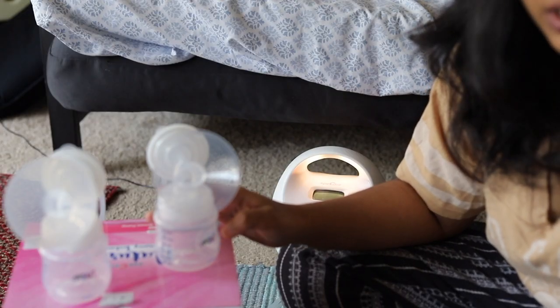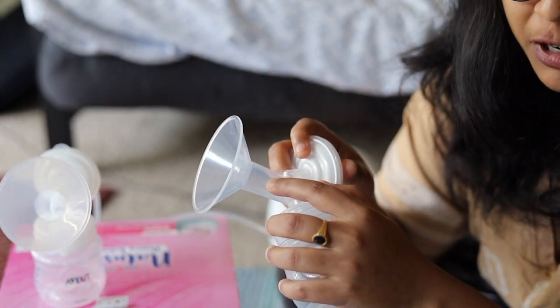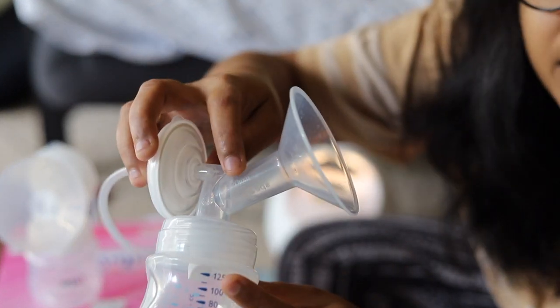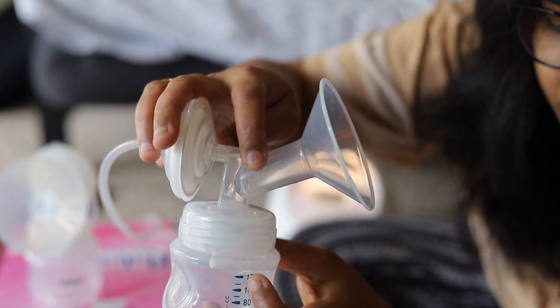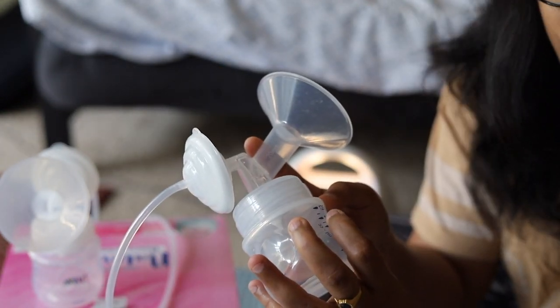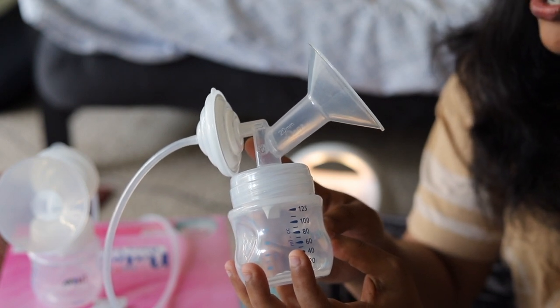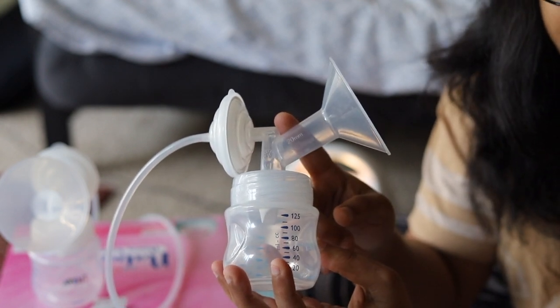Now let me explain the pump parts briefly. First is the flange — the funnel-shaped part that actually goes on to the breast. On the side there is a number listed, for example 20 mm, which is the nipple diameter. You have to choose the one that fits your size. If you use an incorrect size this can lead to sore or cracked nipples or clogged milk ducts, which leads to pain and inflammation and may even lead to discontinuation of breastfeeding.